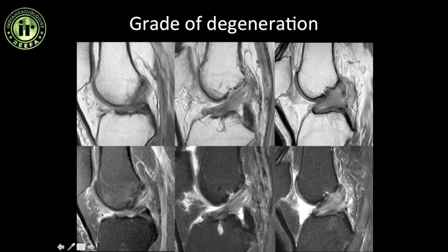In a mucoid ACL you need to mention the grade of degeneration, which is mainly based on eyeballing. This is mild degeneration, this is moderate, and this is marked mucoid degeneration.